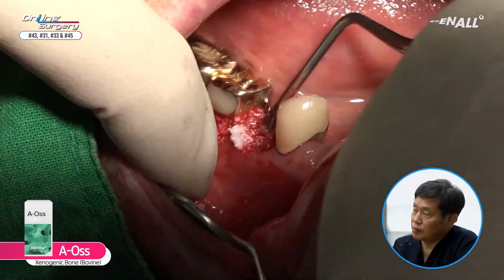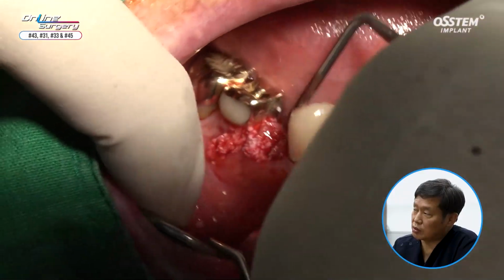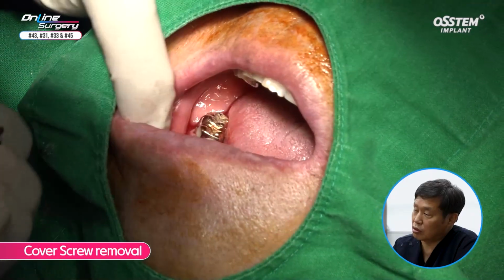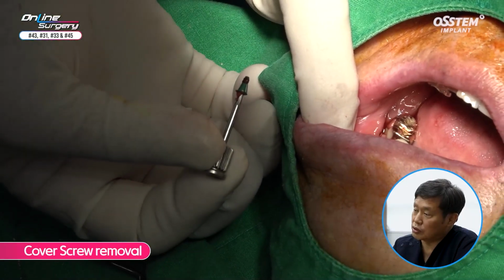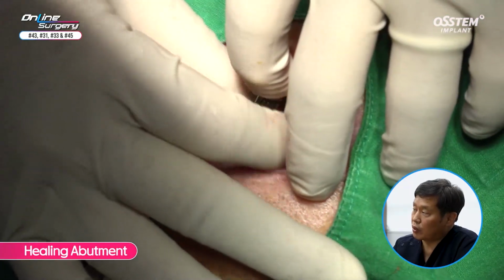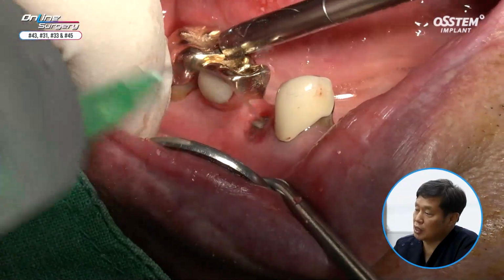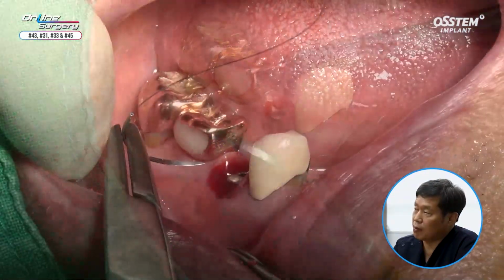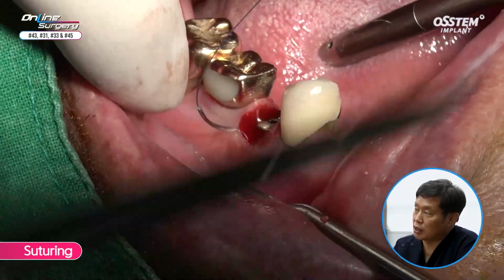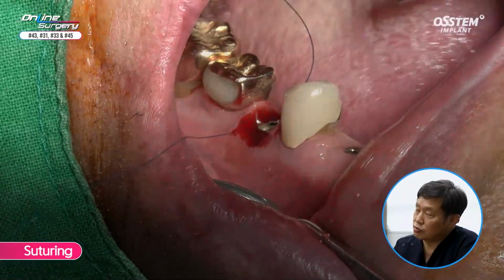And on the buccal side, sufficient bone graft was done. In the buccal gap, if there's healing abutment because of contour, bone grafting can become difficult. Cover screw was removed, and in order to prevent graft material going in, healing abutment was connected. You can see that the extraction socket was full. A suture was barely necessary, but suture was done once.